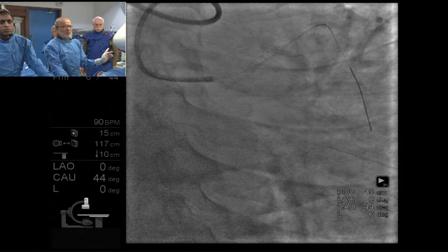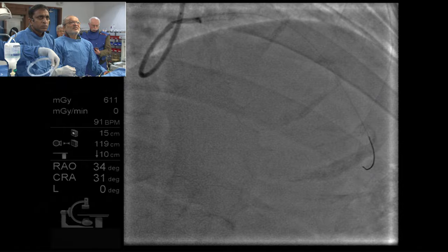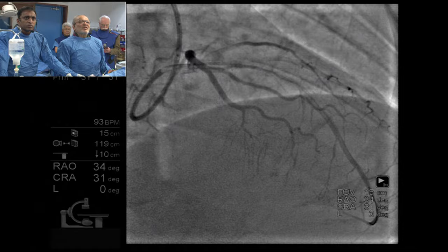We have to be very careful selecting the stent. Now, Orsiro is available. Long lengths are 35 and 40. I think the mechanism of restenosis would also be important, with imaging to see if it's under-deployment. 3x35 or 40?